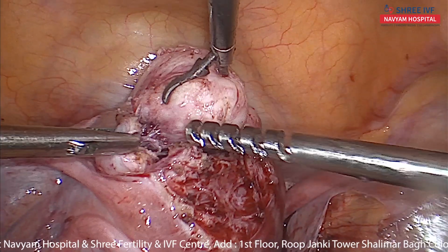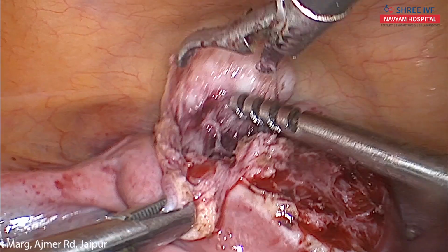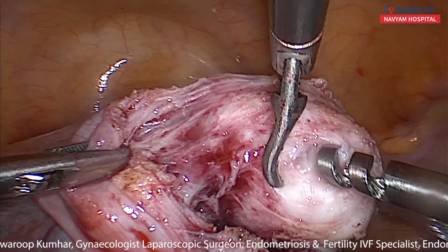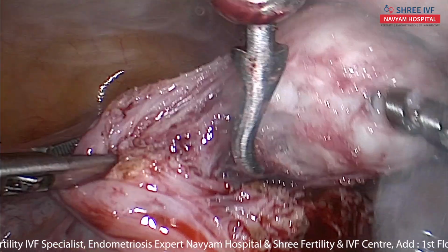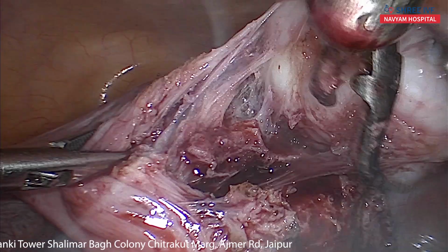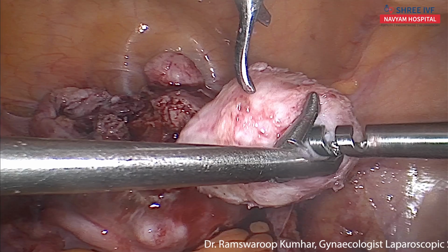Now, the traction is being applied to another site for this myoma. And these myometrial fibers are being removed away. Myoma number 2 is out.